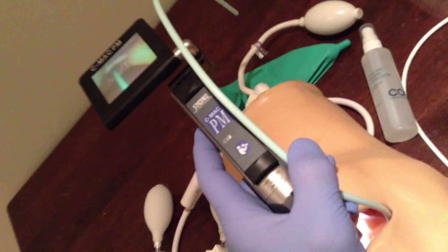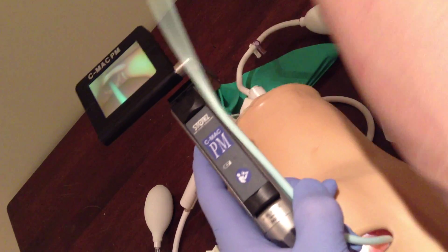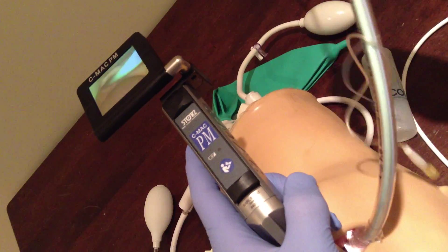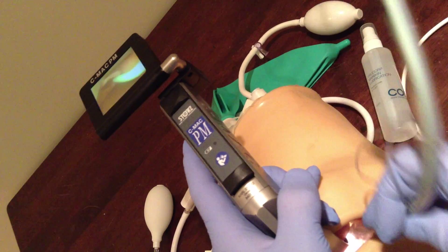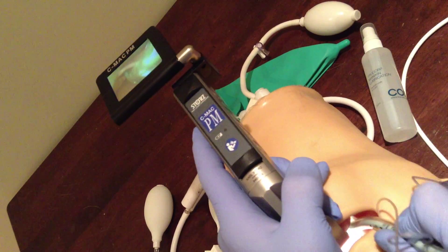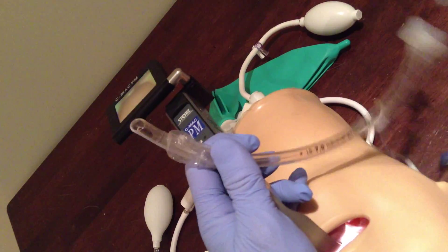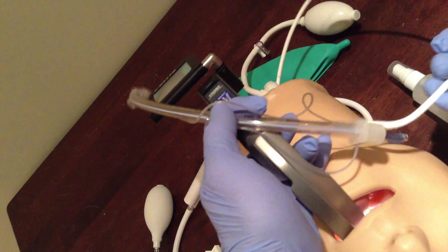Lock it down. Get your tube on and pass your tube. Came out — I can just barely fit it through there. It's not lubricated so it's going to be hard to pass. The pocket bougie on the other hand is just a little bit easier to manipulate. And let's put it in that D-grip maneuver. There we go.